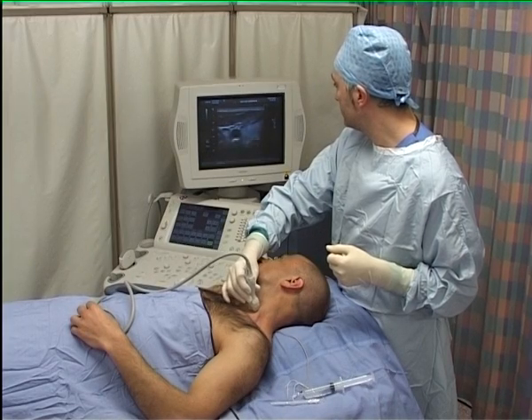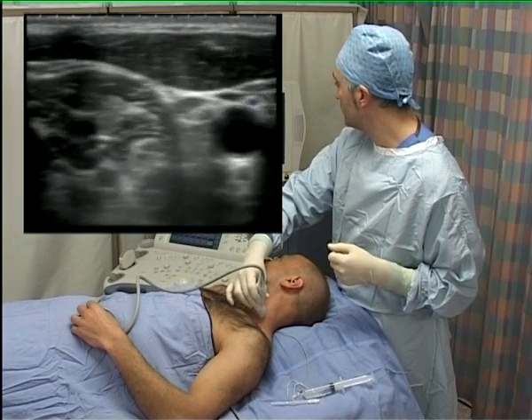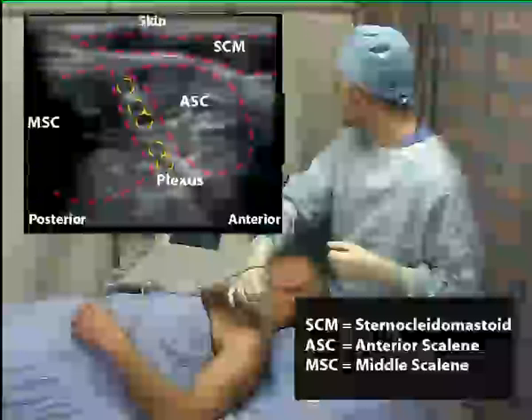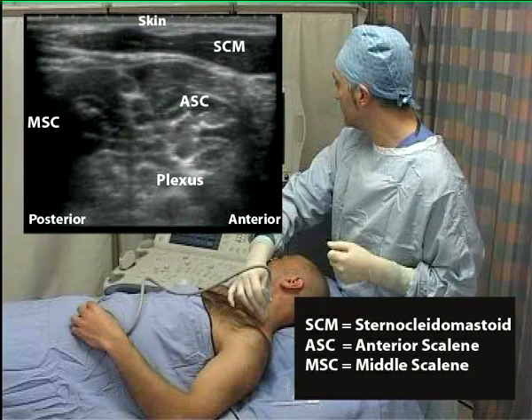The probe is slowly moved outwards from the midline at about the level of the cricoid cartilage to reveal the lateral border of the sternocleidomastoid muscle. The interscalene groove, lying deep to this, can usually then be identified between the bellies of the anterior and middle scalene muscles. The brachial plexus, the roots of which appear as dark hypoechoic round structures at this level, lies within this groove.